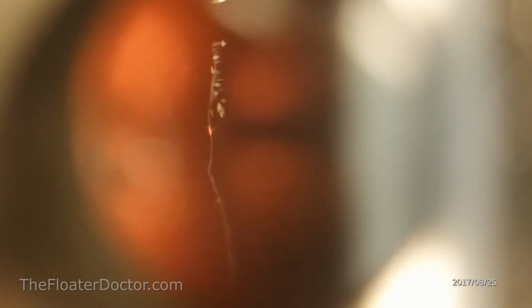But this does show up pretty well, and you can also see that this thin little wispy strand is like rubber. It's just taking a beating, and it's not really easily vaporizing or being severed. So even the ones that don't have a lot of mass or volume to them can be a little bit of a challenge as well. So anyways, we'll let this wind down. It's just a good example of some of the variants out there.